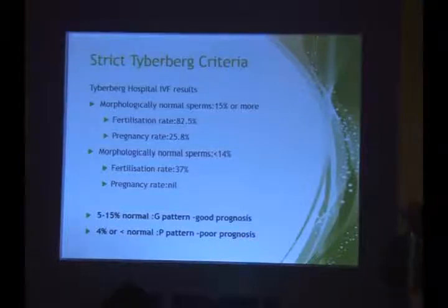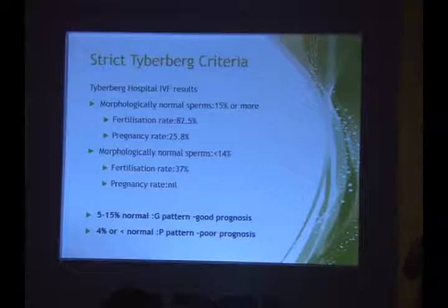Most of the andrology labs, even in 2015, are still reporting rapid progressive, sluggish progressive. So they have not adopted the 2010 manual either for motility or for morphology, but we all have to adopt. So we are now quoting the 2010 manual in most of the reports. But this was the reason why it was not very well accepted.